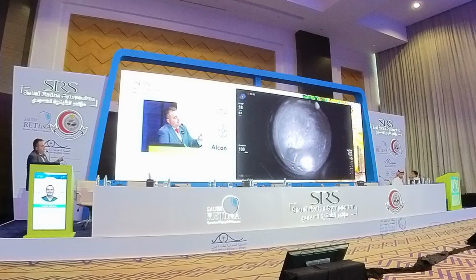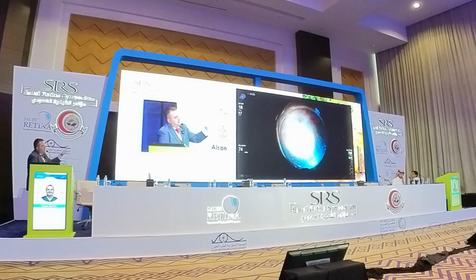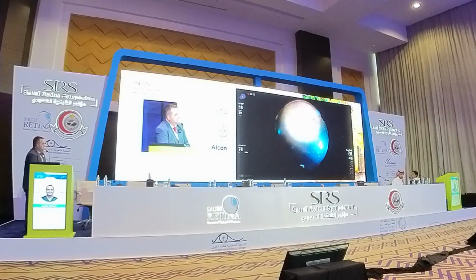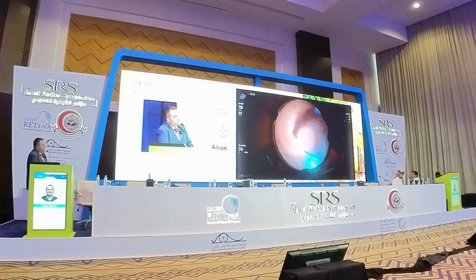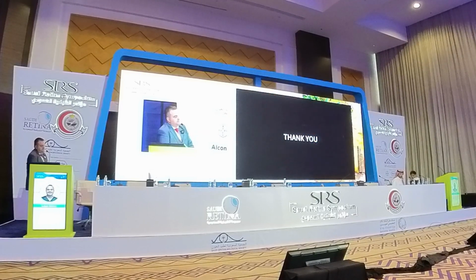So here is the intraoperative guided laser, and you can see that on the temporal part, the laser is heavier compared to the perfused retina. Next thing that you might do is endodiathermy under fluorescein guidance. In that case here, it's obvious where the spots are. But anyway, it can be useful to check if there is active bleeding. Thank you.